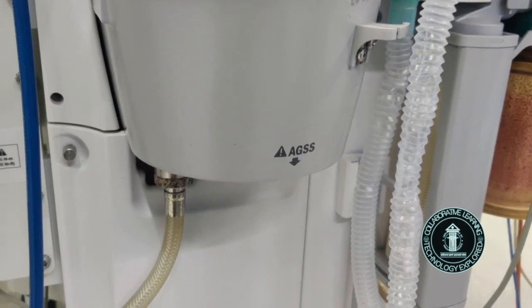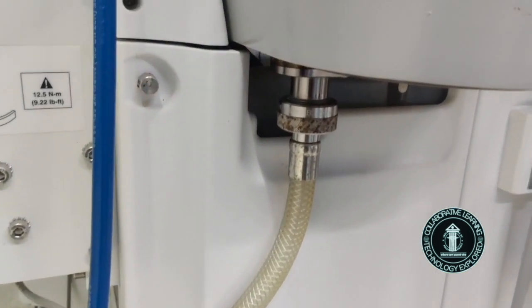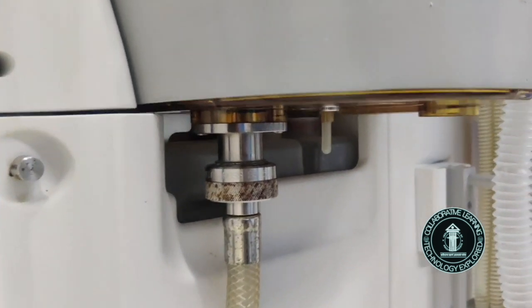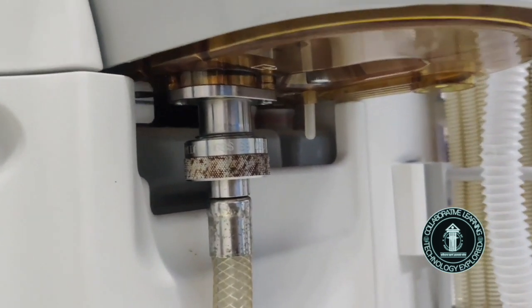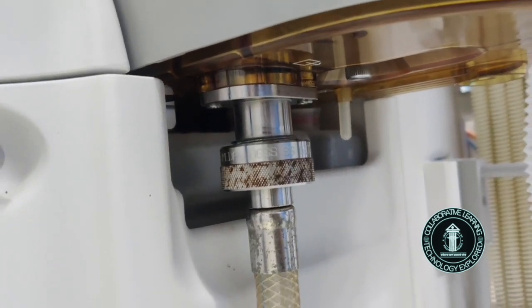So the collecting system is something which gathers the excess waste gas from either the APL valve or the exhaust port of a ventilator. And the transfer system is that corrugated tubing which carries these gases from the collecting system to the disposal system. And the disposal system is what we have explained right now. That's either active or passive.